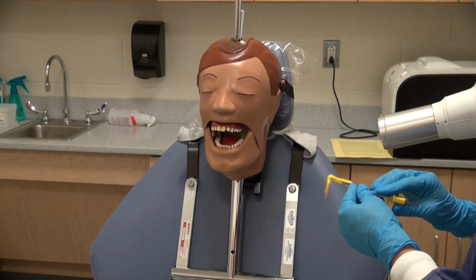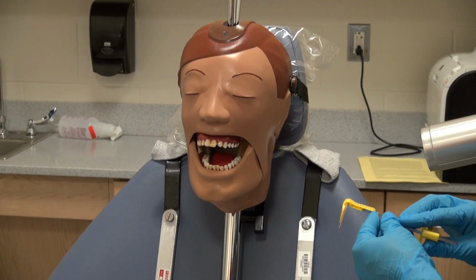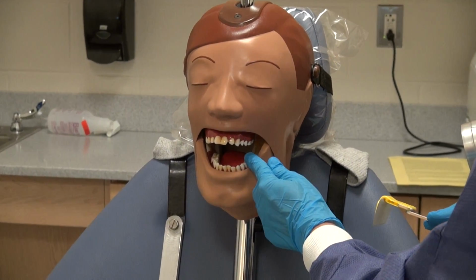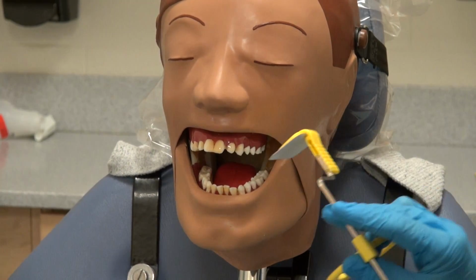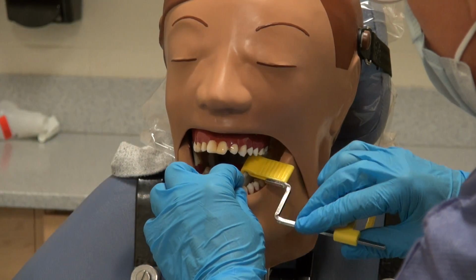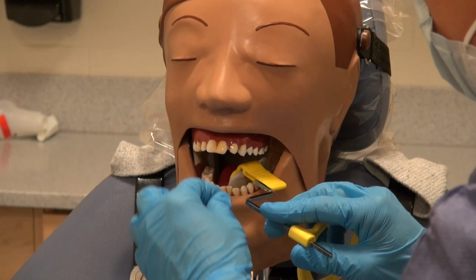For the mandibular premolar image, we want to cover with the film packet the entire canine, first premolar and second premolar, and part of the first molar. Place the film into the floor of the mouth and look through the ring to make sure that the mesial aspect of the canine is covered. This is one of the most challenging films to get anatomically.